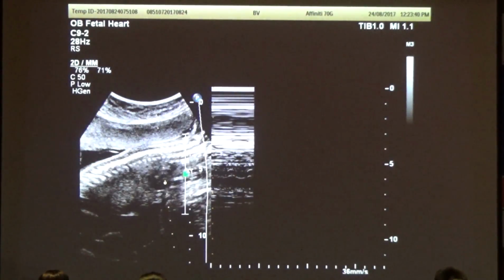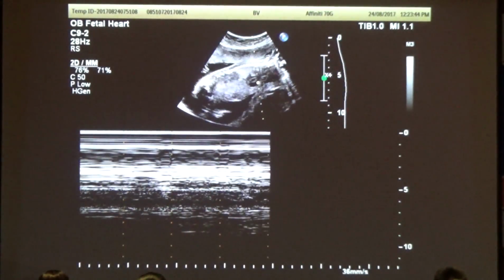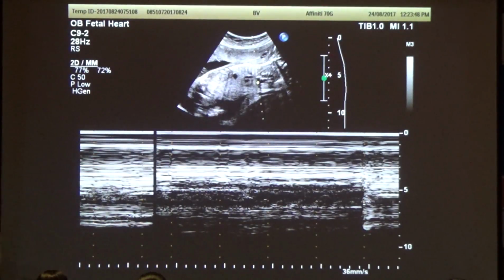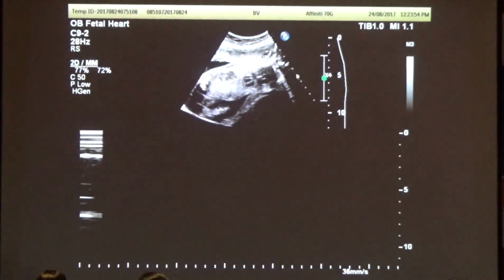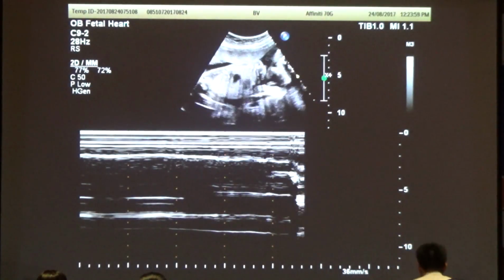I know a lot of people don't want to do that, but I do it. You can tell a hell of a lot from the pulmonary artery, from the aorta. Okay, now I've lost my signal, see? I'm looking at the atrial septum now. Now I'm in the pulmonary artery. Now I want a bigger image. You make all my images smaller for me.